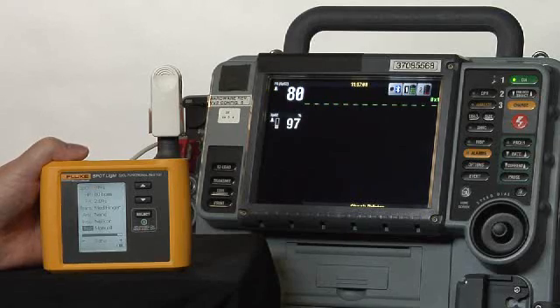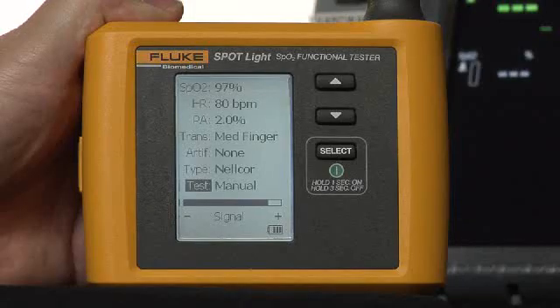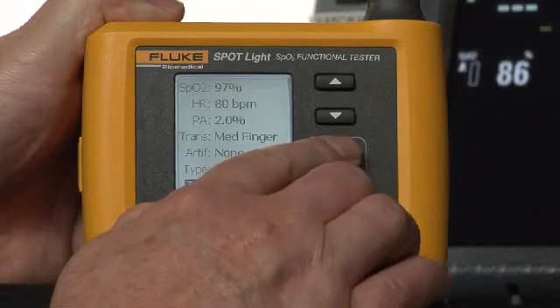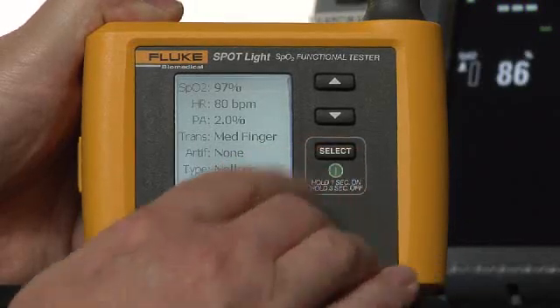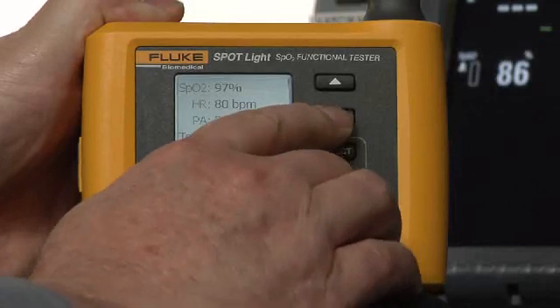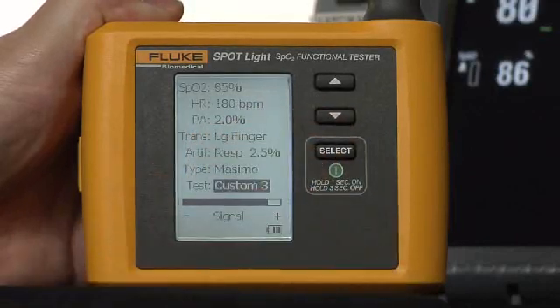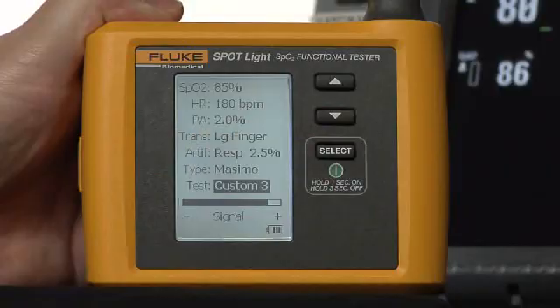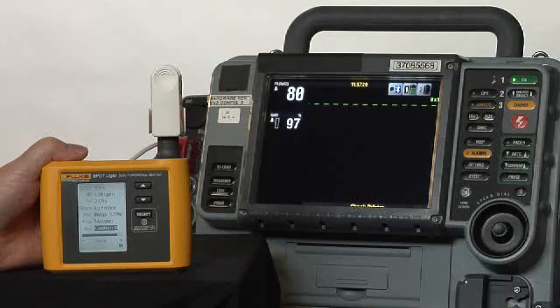Now, testing this functionally really quickly is just a four-button push. We're going to go to our Custom Setup and go to Custom 3, which is programmed for a patient with a high heart rate and a high O2 sat.